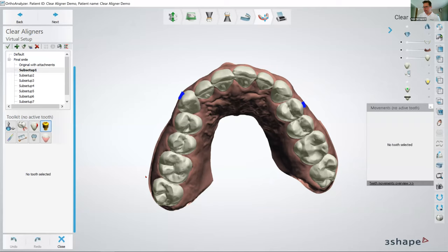So let me just check the Q&A, and Jan, feel free to fill in if you see some questions that I don't. I have it over here on a different screen. We're having a lot of questions about the sub-steps that we are making, but again, coming back to your disclaimer, sub-steps are often a discussion for the orthodontist or the well-trained orthodontic general dentist, knowing how big steps you can take and so on. But we have the tool, as you said, in the software to frame and prohibit bigger movements than allowed, so there are some limits already set. Can you comment a little bit more on that?